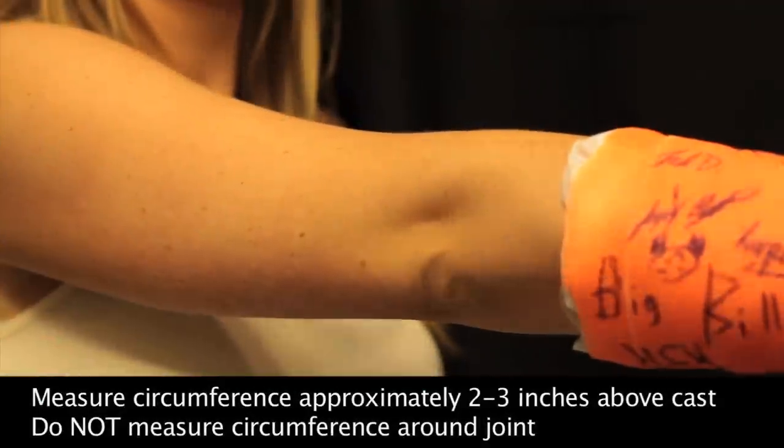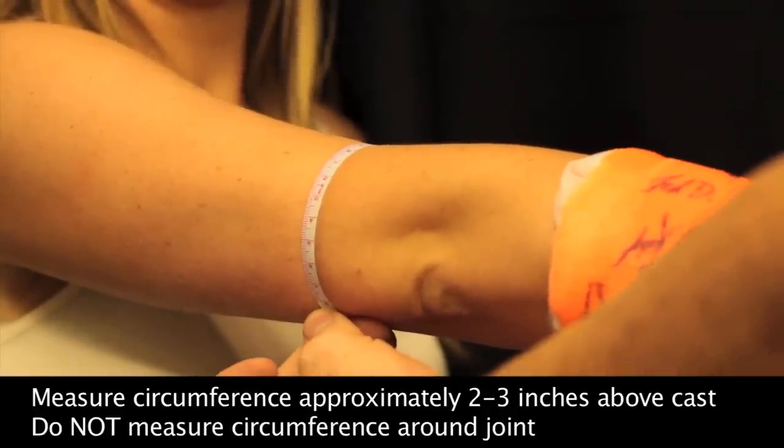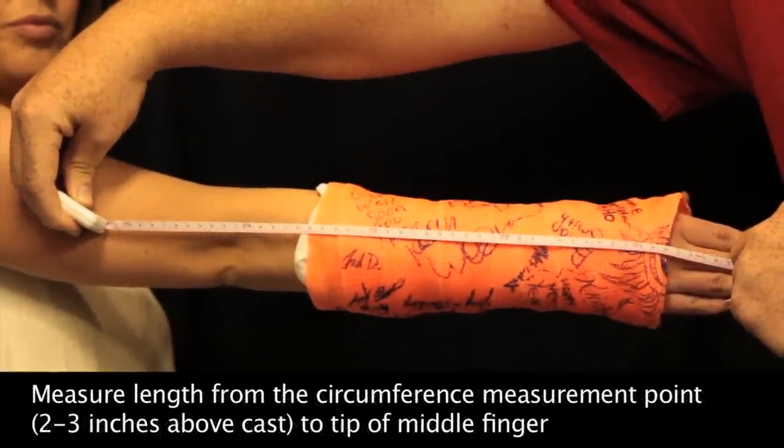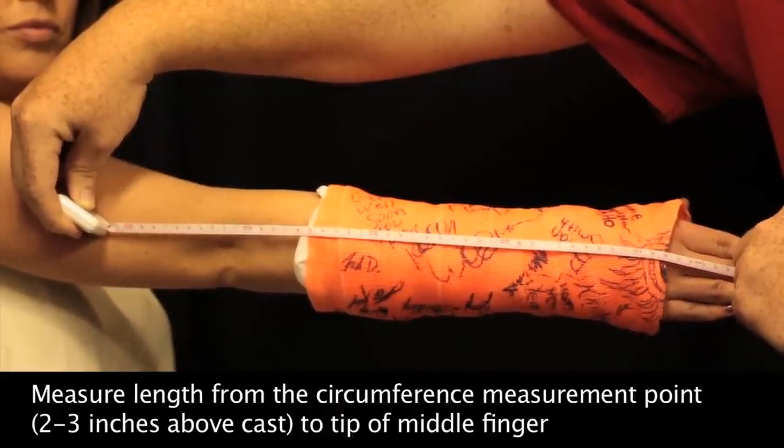Begin by measuring the circumference approximately two to three inches above the top of your cast, making sure you do not measure around the elbow joint. To get the correct length measurement, begin measuring from the same point you got the circumference measurement and measure down to the tip of your middle finger.